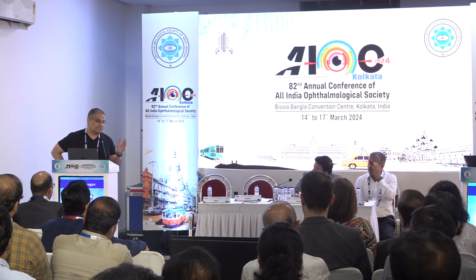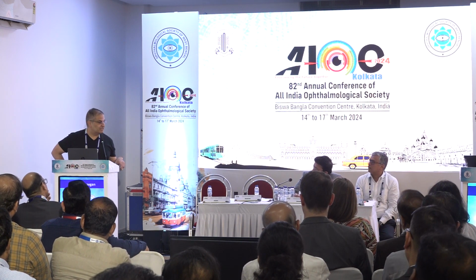And that's how I use it too. I don't ever put it bilateral. I think that's a mistake. And so in that lens, just be careful. It also requires a bigger incision. And if you need to YAG them, you have to YAG a very special way outside of that central zone.